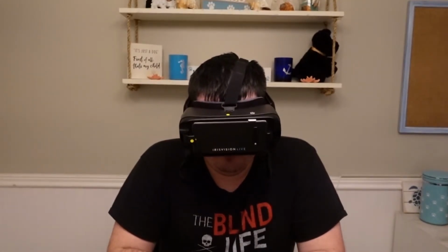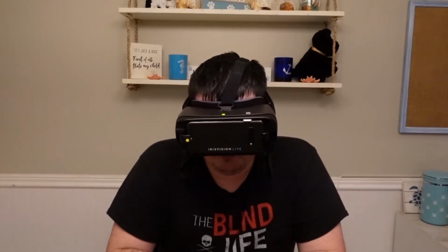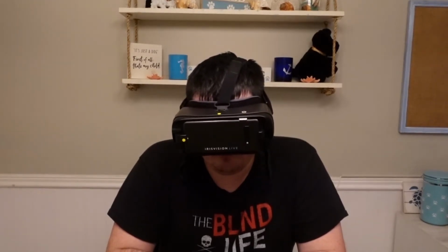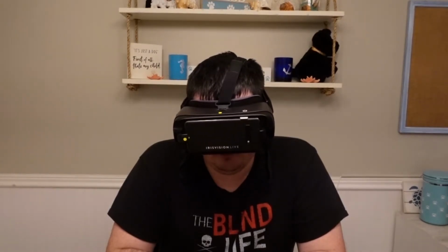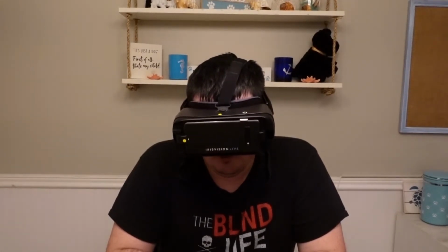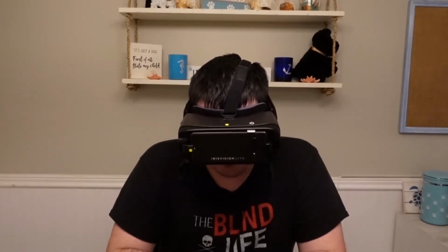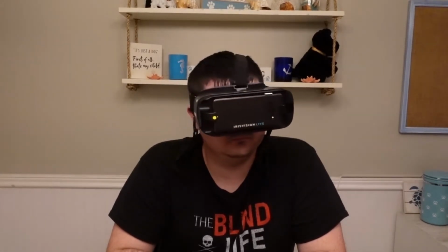is very helpful. For those that are not familiar with OCR, basically it's exactly what we just showed. It uses a camera to take a picture, and then it has the software that allows it to identify the text within that picture and then read it. So if you were to take, say, a picture of a $10 bill, it could read you not only that it's a $10 bill, but it could also read off the code that's on every individual bill. And then the same goes for a document. If you have a document that says, I like cats, take a picture, it's going to read back, I like cats.